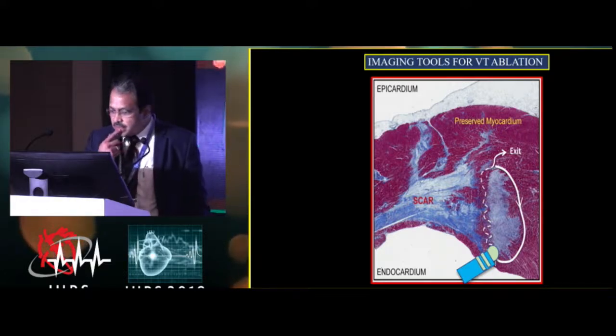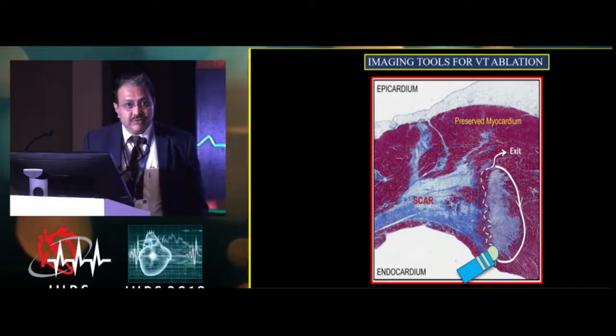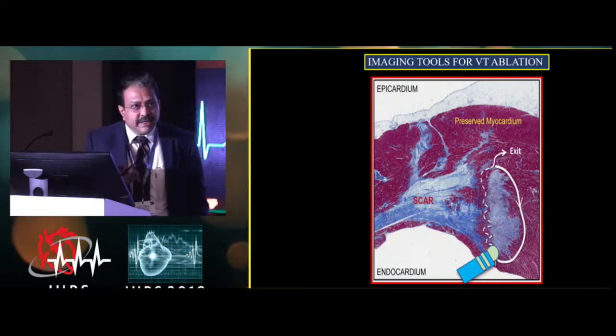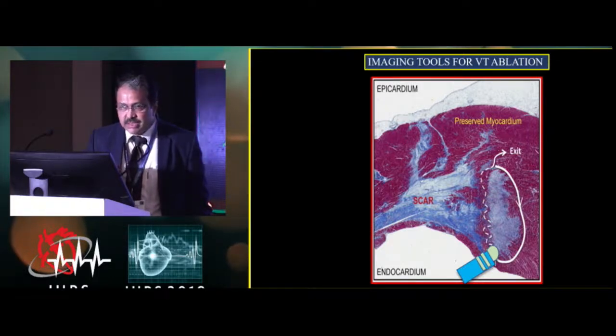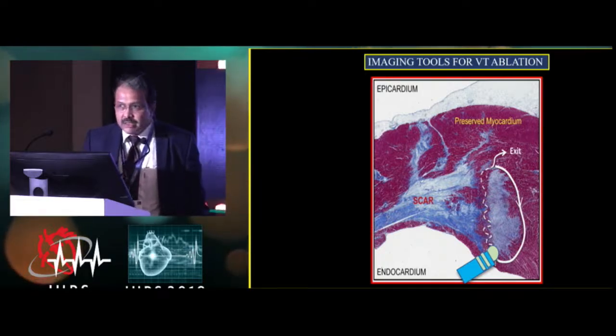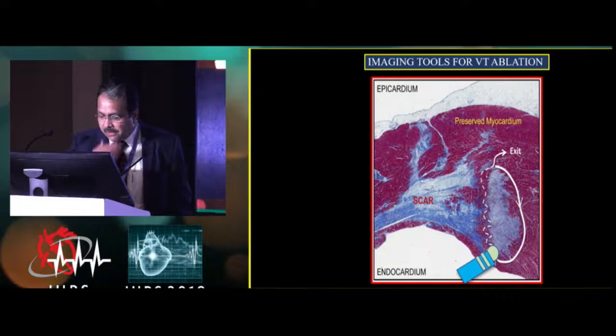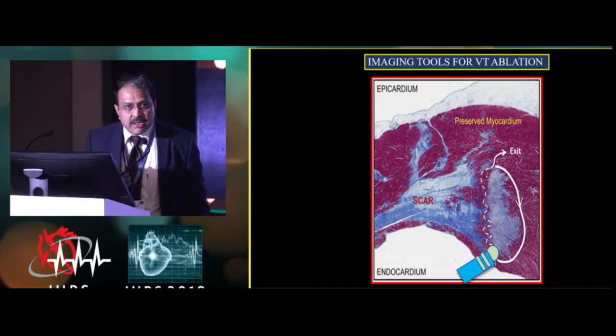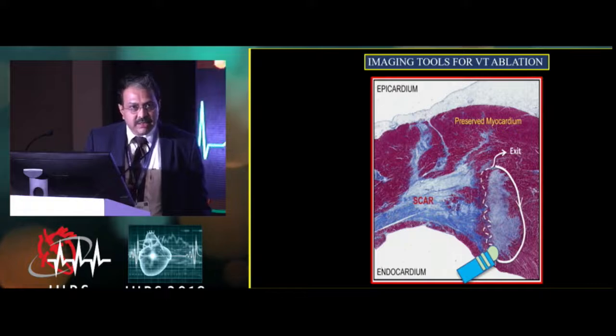It's also important whether you would be able to actually visualize in real time the movement of the ablation catheter, whether it is accurately at that spot where you thought you identified the substrate, and whether the catheter is causing any damage. So if you are prepared with these kind of imaging, acute and short-term success rates are better.